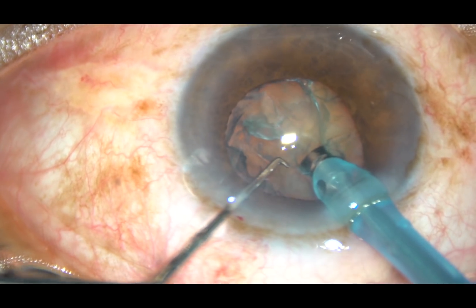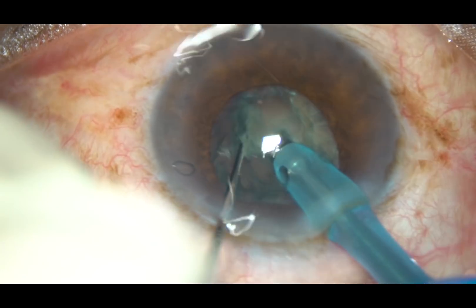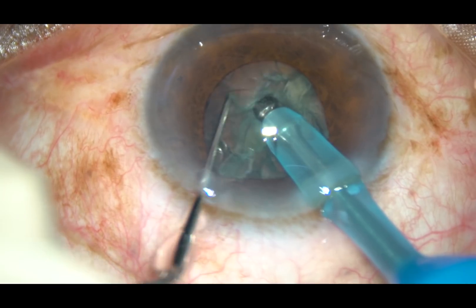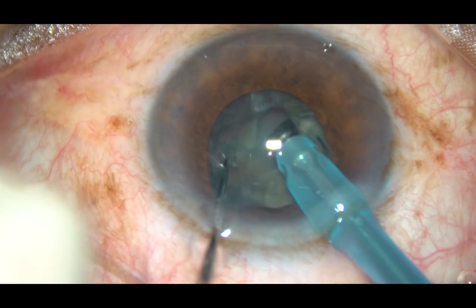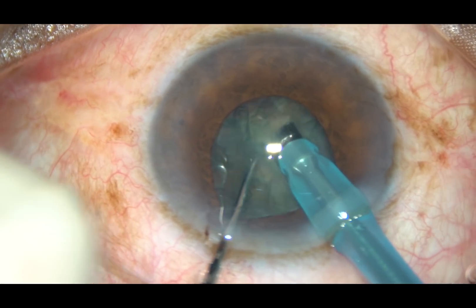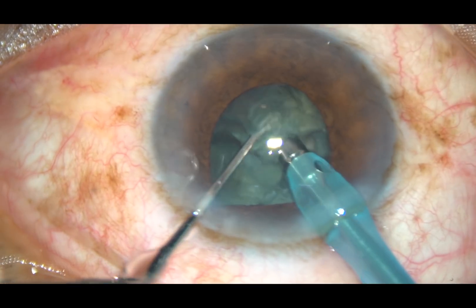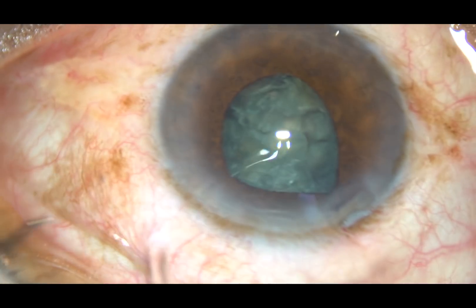At this moment, the phaco is in and I'm going to remove some superficial cortical lens matter before I bury the tip and attempt direct chop. Now see what happens — as soon as I apply vacuum to bury the tip, the pupil has become very small and the iris has got incarcerated in the side port, and it is tending to prolapse through the side port.